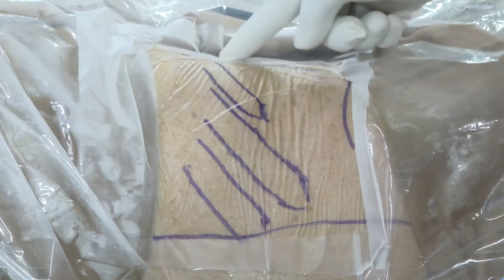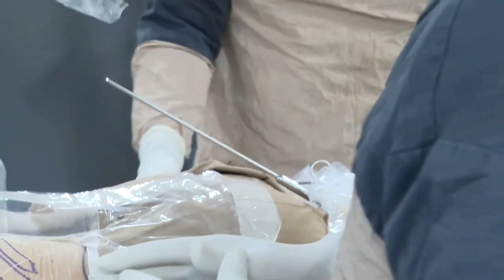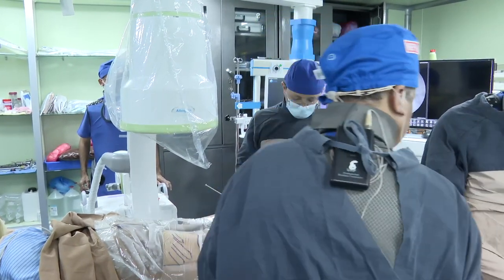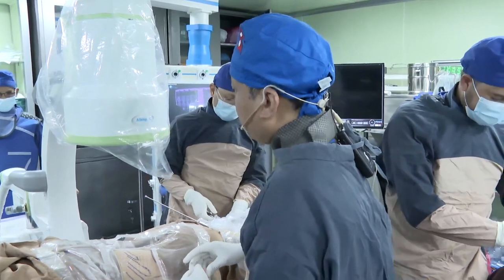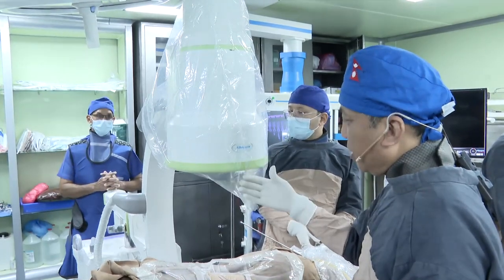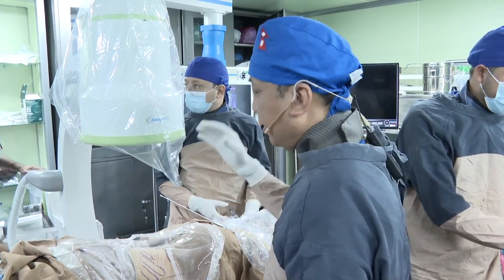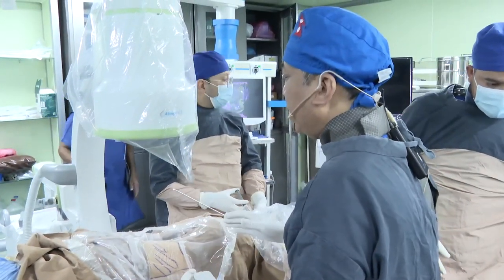I prefer to keep the abdomen free most of the time so that ventilation is good. My puncture is supracostal mid calyx in 70% of cases. Most of the time we make a puncture free hand at zero degrees, and whenever there is doubt we go with C-arm at 30 degrees.